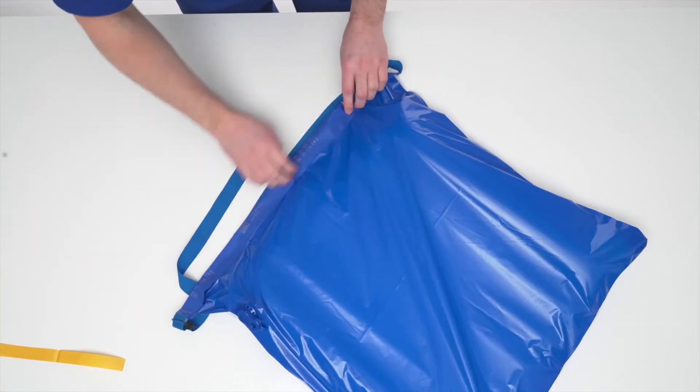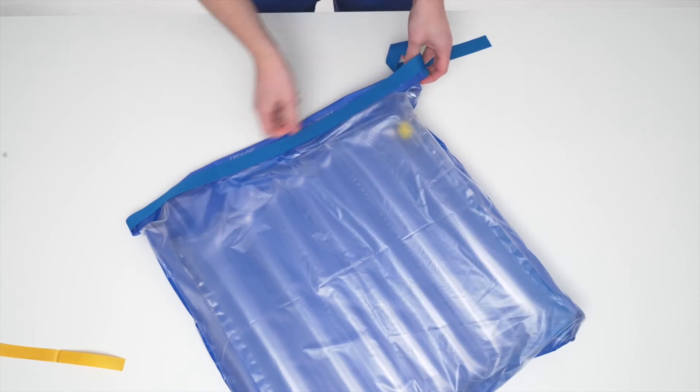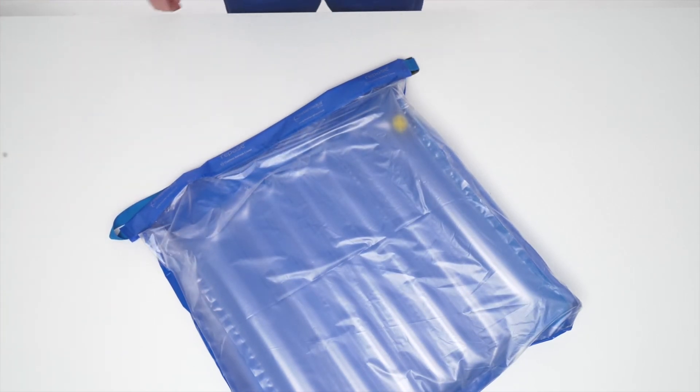Fold over the blue edging tape and press firmly, ensuring a firm fit against the top surface of the outer cover material. Continue until all the blue edging tape is securely set in place.